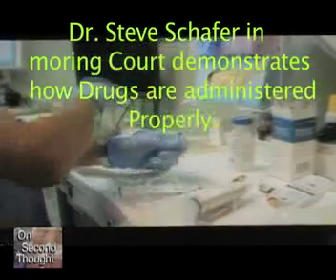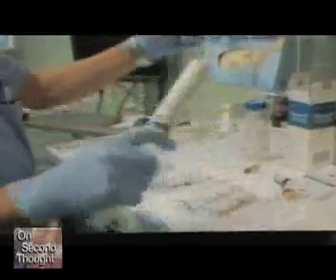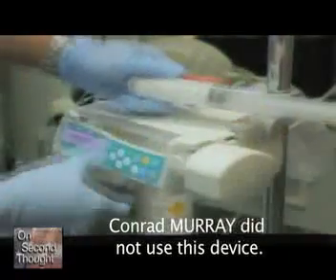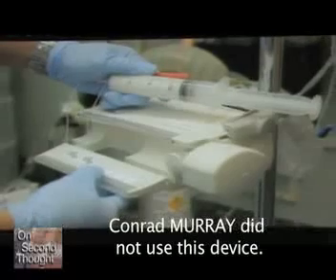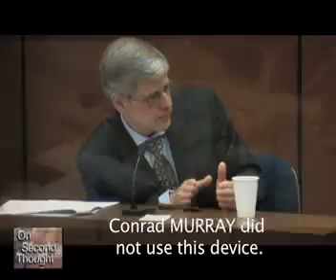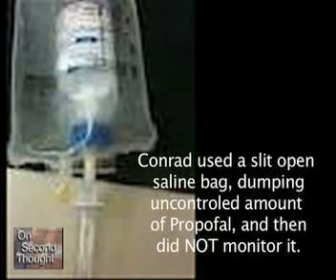The cap off. That one was glued on. He then pushed the air all the way through so that the tubing was only filled with propofol. Now he has the syringe, he has the tubing, now he has to put it into the pump itself, and then load it into the infusion pump, if you may continue.